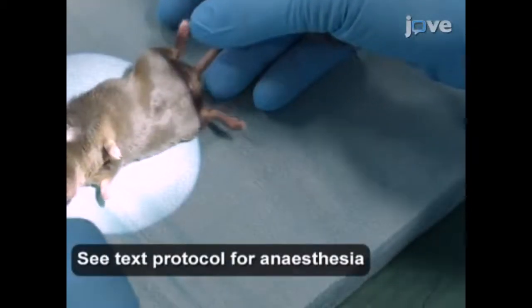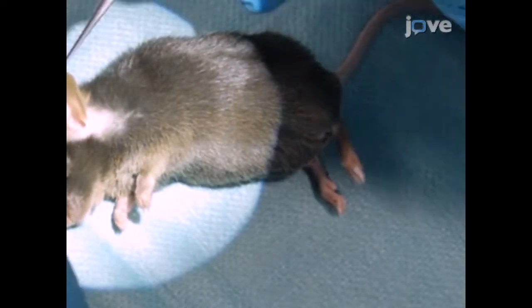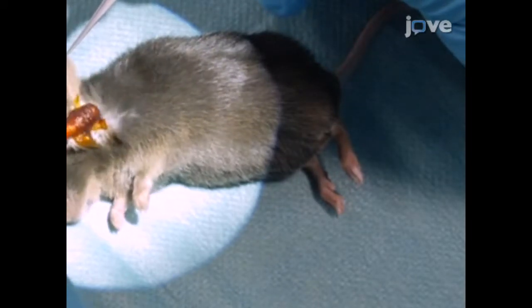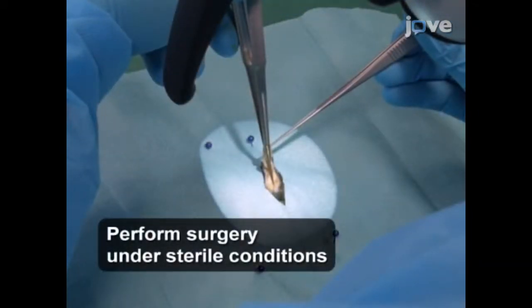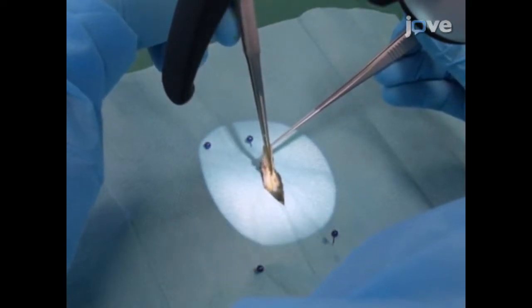Place the mouse in the lateral decubitus position and prepare an aseptic surgical area below the external auditory meatus as previously shown. After making a 0.5 cm longitudinal incision in the vertical part of the outer ear canal, locate the tympanic membrane with the aid of the surgical microscope. Identify the upper pars flaccida and the inferior pars tensa, which is divided into anterior and posterior sections by the handle of the malleus.